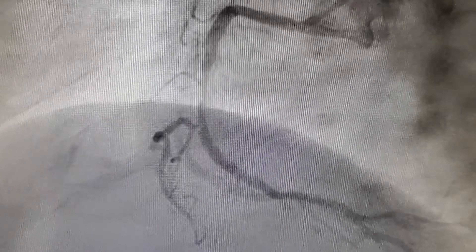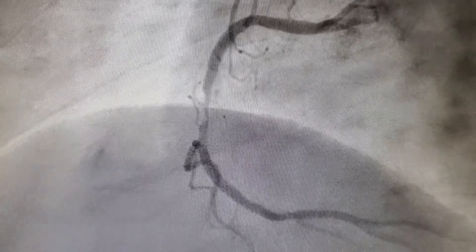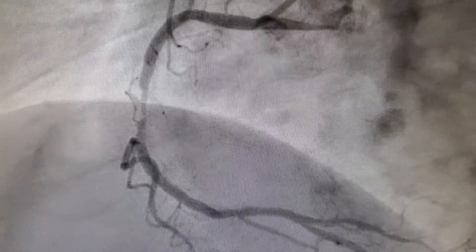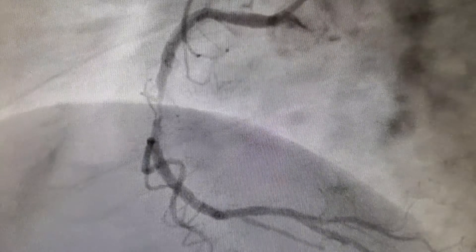A contrast material is injected and the blockage can then be easily seen on the x-ray. On the left hand side of the screen, you can see in the video that there is a clear blockage in the middle of the right coronary artery when the contrast is injected.